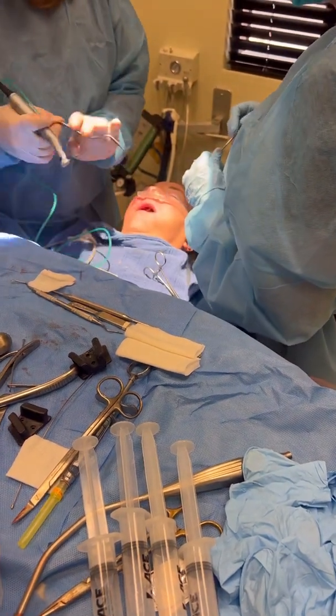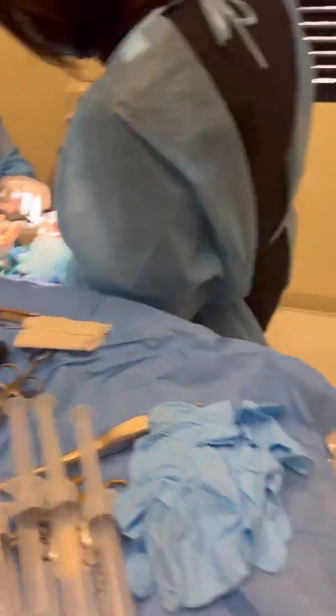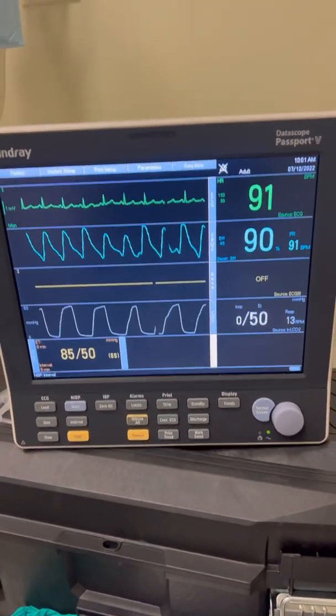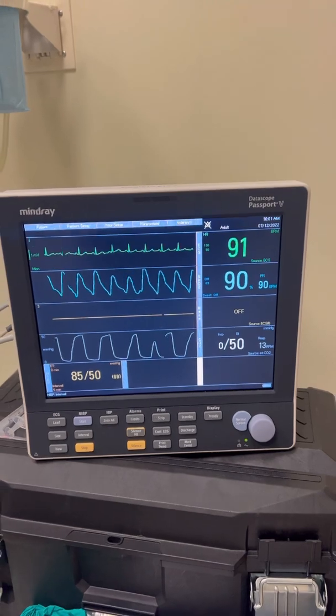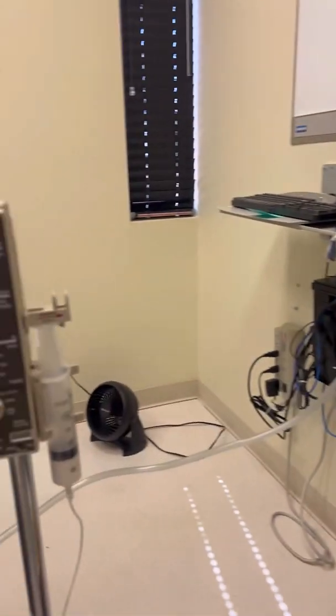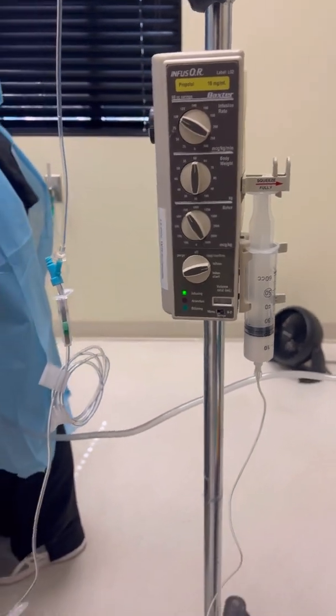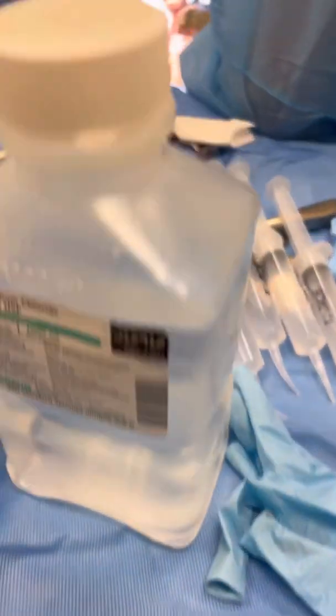We're done with bone reduction — now we're going to start implants. I have the propofol pump essentially going the whole case. You can see her CO2 — she's breathing nicely, 13 times a minute. The pressure just got to about 85 over 50, which is about as low as it got and about as low as I wanted it to get. She had no heart problems, but I don't want it lower than that.